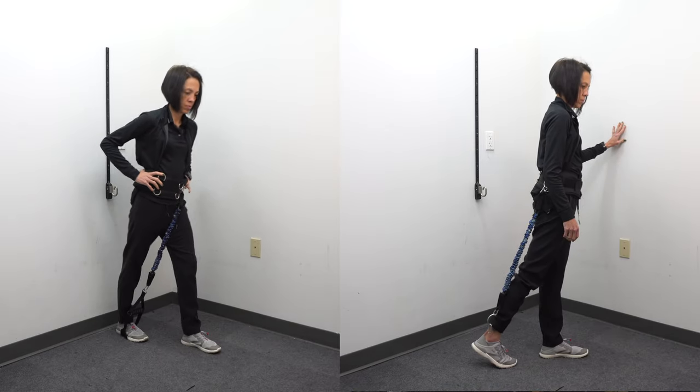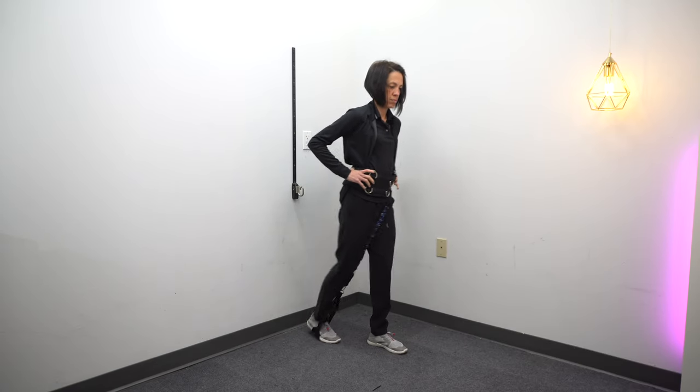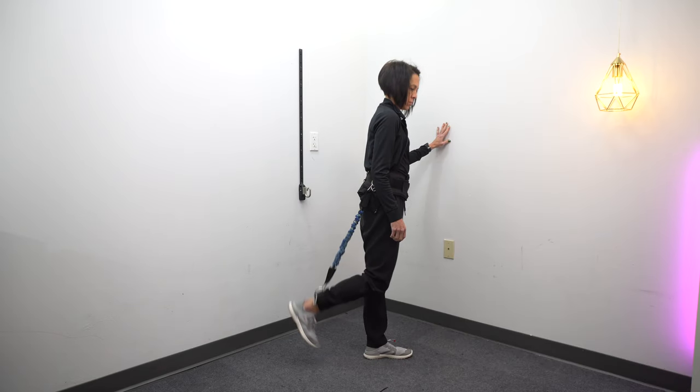For the functional component, figuring out what the biggest problem is for you is key. If you can't flex your hip and bring the knee up towards your chest, put the band in front. If you feel like you just can't unlock your knee — which is the case for most people — put the band behind. In my experience, for the majority of people it's bending that knee, so I put the band in the back to help unlock it and bring that leg through.